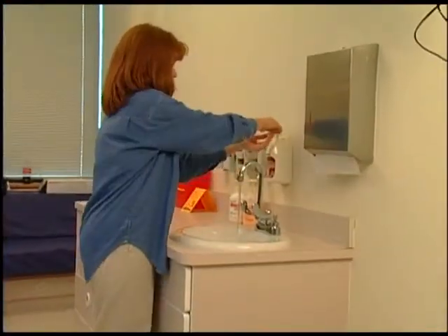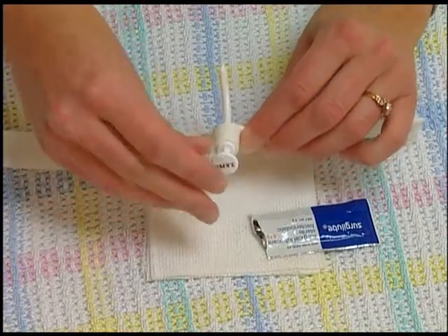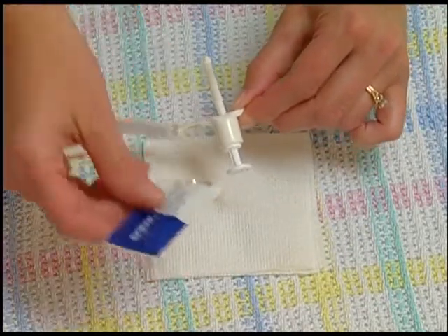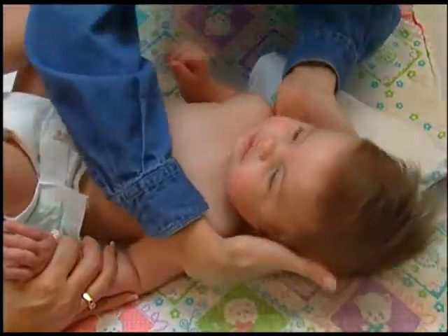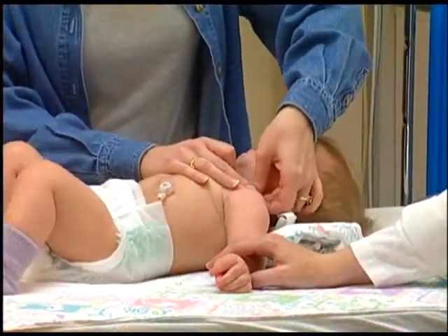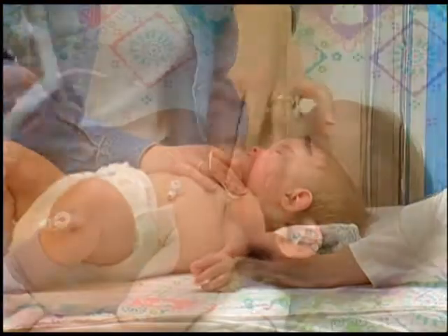First, begin by washing your hands. Insert the obturator into the tracheostomy tube and attach the trach ties. Lubricate the end of the new tube with a thin layer of water-based lubricant or a couple of drops of normal saline. Place a rolled towel or blanket under the child's shoulders and have a second person hold the child's arms while you remove the trach ties. If a second person is not available, a small child can be swaddled.